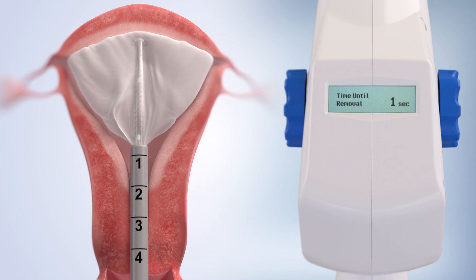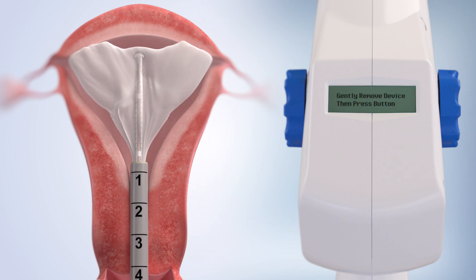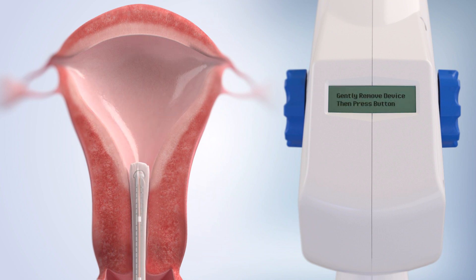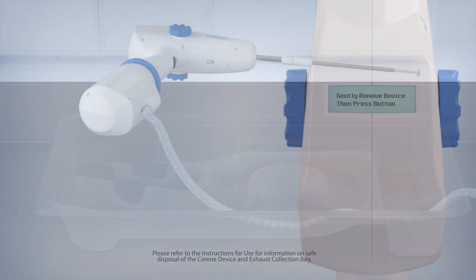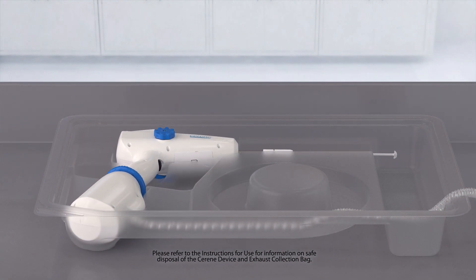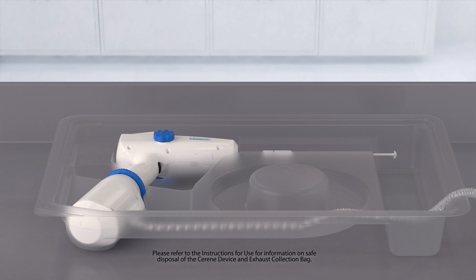Once the device removal countdown is complete, gently withdraw the Serene Device from the patient. Press and release the button and set the Serene Device aside to complete venting of any excess nitrous oxide. Once the LCD screen indicates the Serene Device is safe for disposal, disconnect the exhaust collection bag.